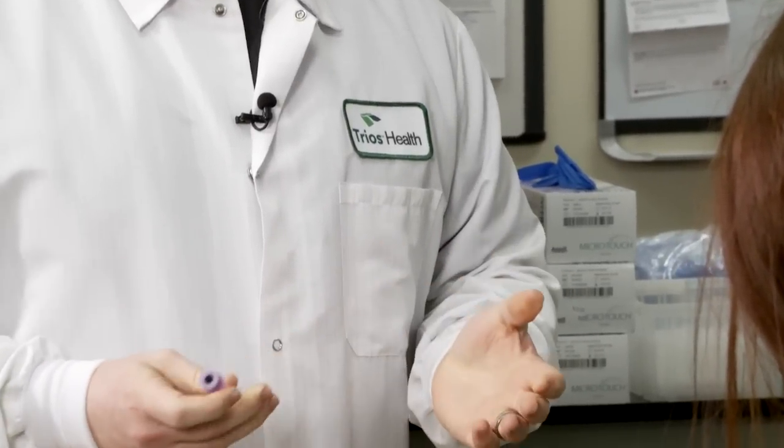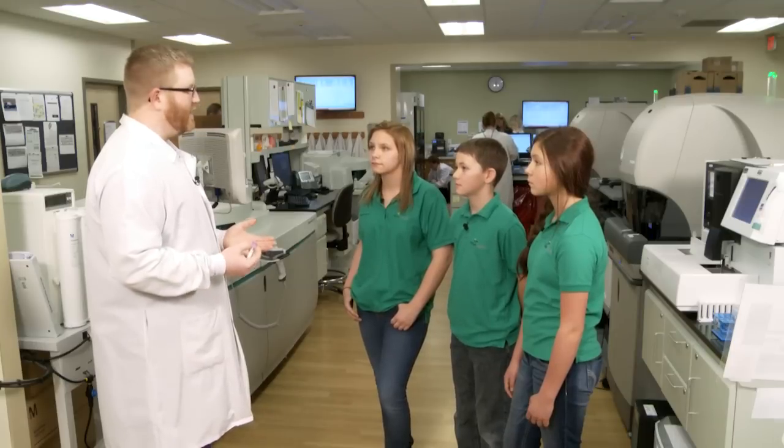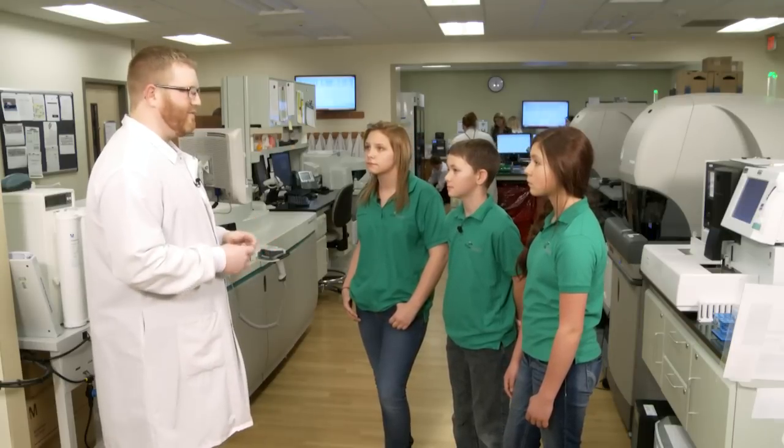We count the white cells, the red cells, and the platelets that are in your body. The doctor can use that to tell if you have an infection — if you have lots of white cells, since your white cells are what fight off infections. You can tell if you have something called anemia, where you don't have enough red blood cells. You can even tell if you're dehydrated.